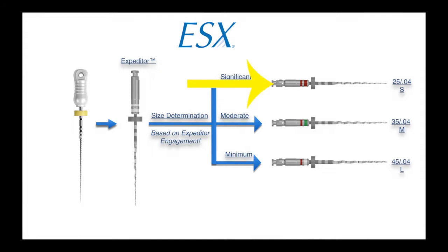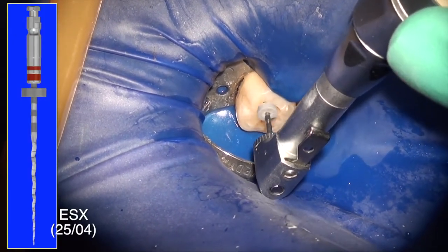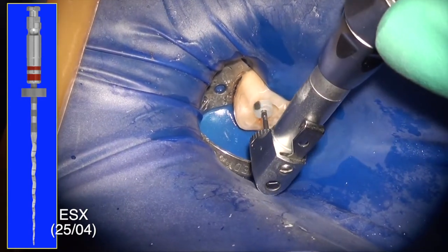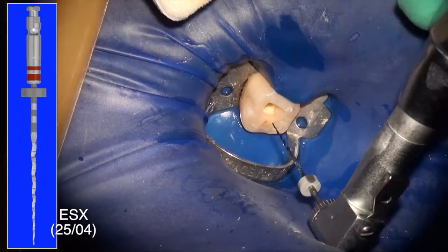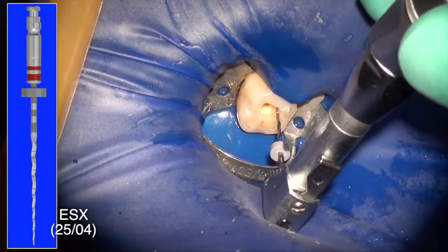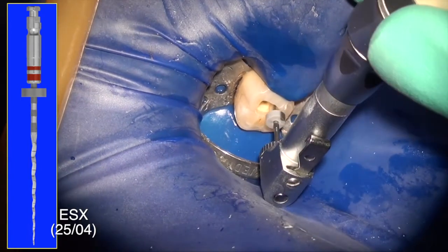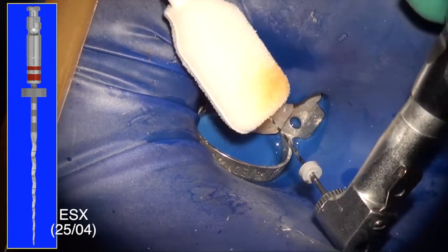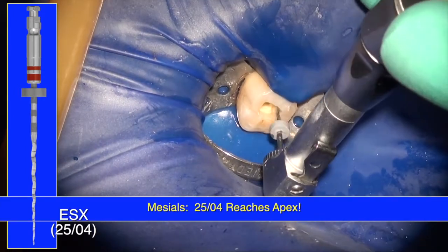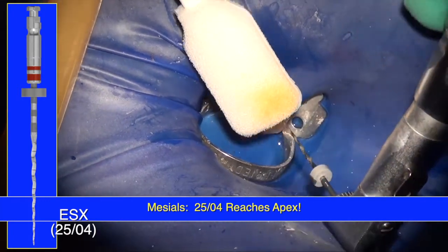On the mesials, however, I'm going to go with a finishing size 25 because you saw that there was a significant amount of engagement for the expediter. But even so, after 3 strokes or so, here on the mesiobuccal, I've already reached the apex with 25, and on the mesiolingual, also after about 3 strokes, I end up reaching the apex. So I now have size 2504 in the mesials and 3504 in the distal.